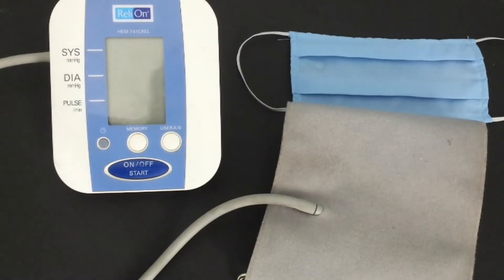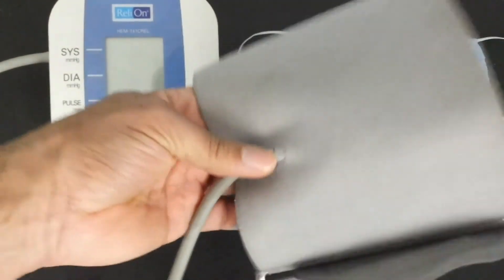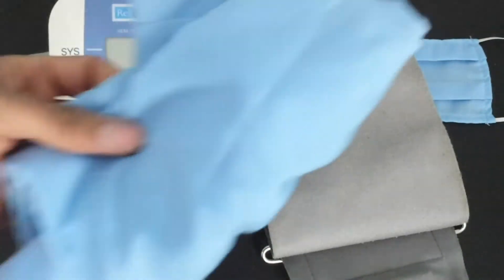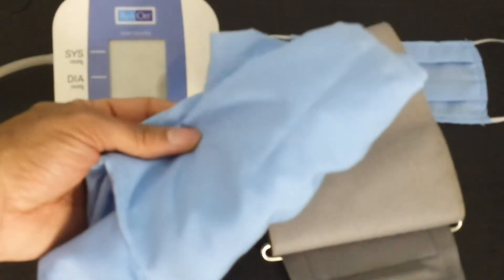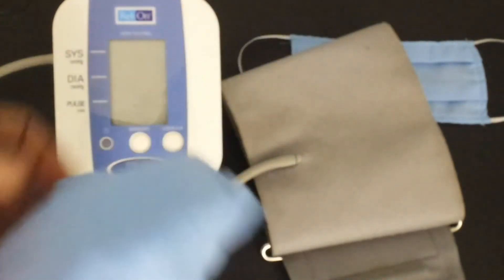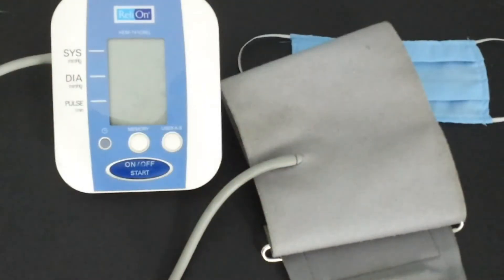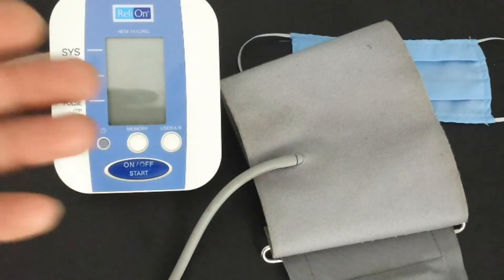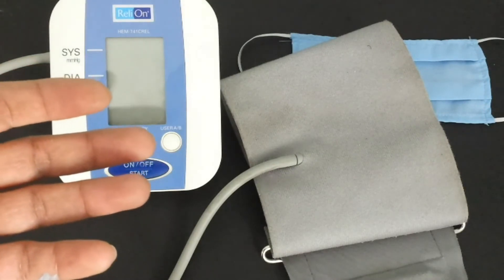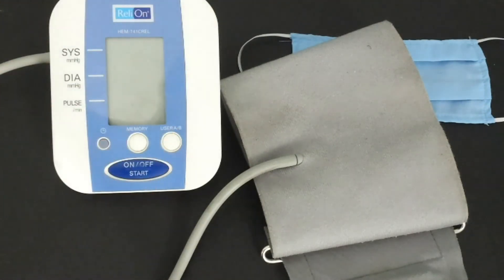Last but not least, remember that when you're measuring your blood pressure, wearing a whole bundle of clothes is like trying to listen to your heartbeat with your hands covering your ears. Ideally the cuff should be on bare skin. Very light clothing like silk or very thin cotton is still possible for the receptor to pick up the pulse, but try to minimize this unless absolutely necessary for modesty.